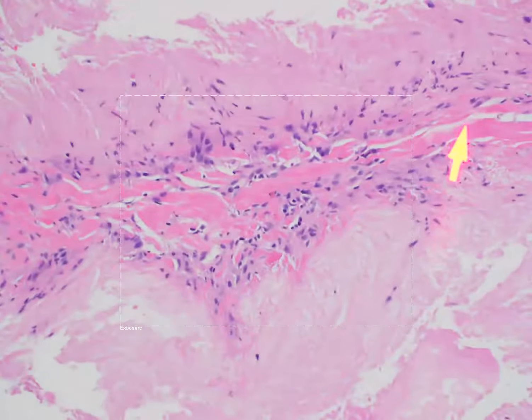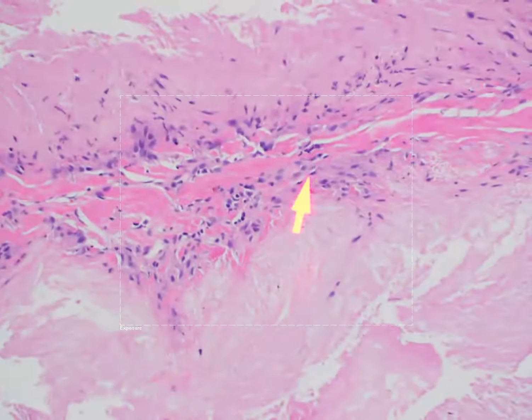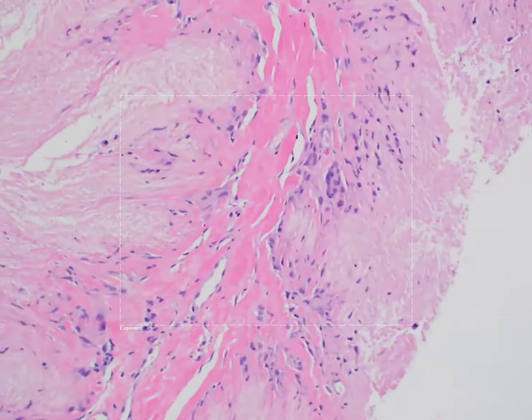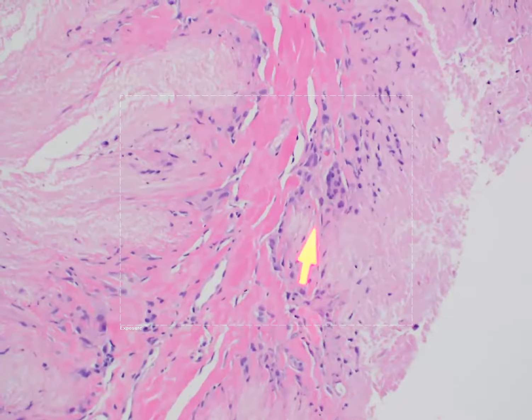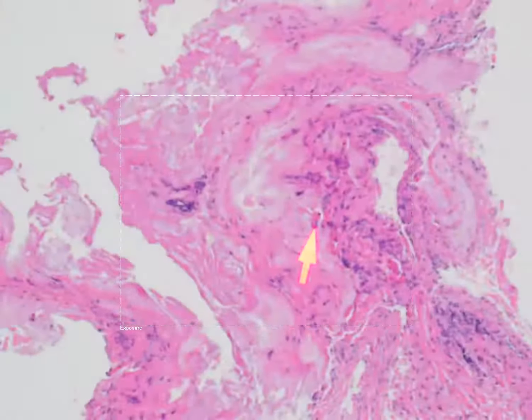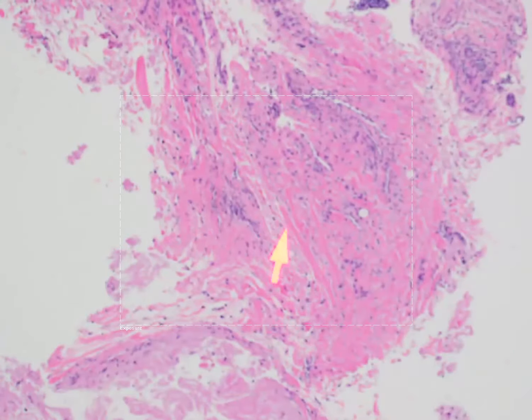And it's fringed by these epithelioid histiocytes that are sort of walling off these deposits because they don't belong in the extracellular tissue. So once again, your histiocytes or your macrophages and your multinucleated giant cells are doing their job of walling off this material. So this is what gout looks like in the skin. Pale pink, cotton candy-like deposits, and it's important to be able to distinguish them from the dark pink collagen bundles.